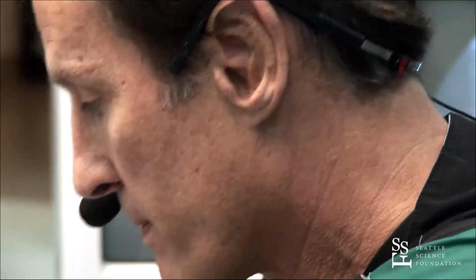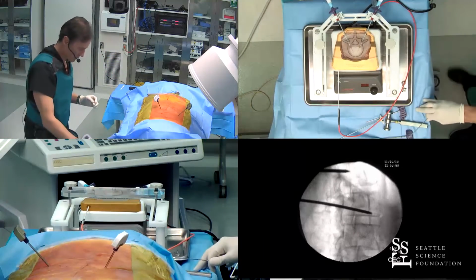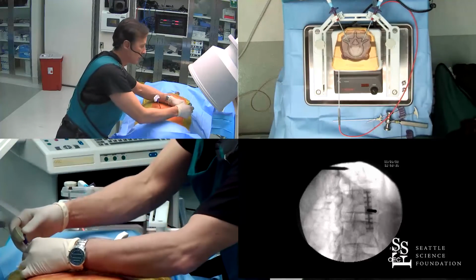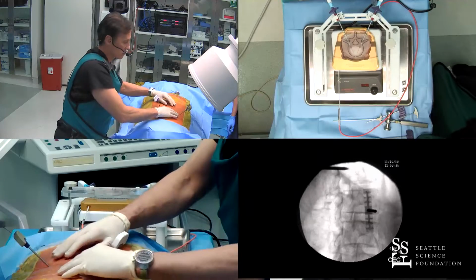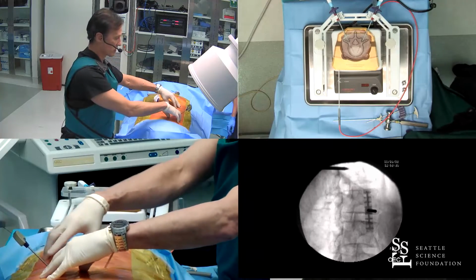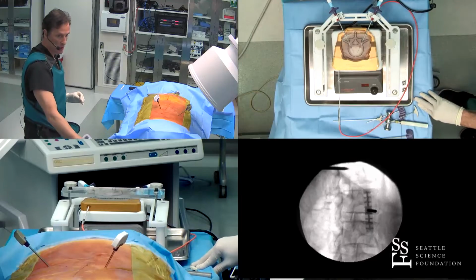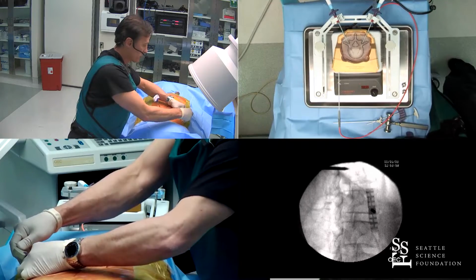And this is done down the barrel of the needle. So just get it under the skin, and you can target it from this. The thing that is different in this cadaver from a real person is we're outside the multifidus muscle with this approach. See how lateral this is? This is a very far lateral approach. And we are outside the multifidus muscle.